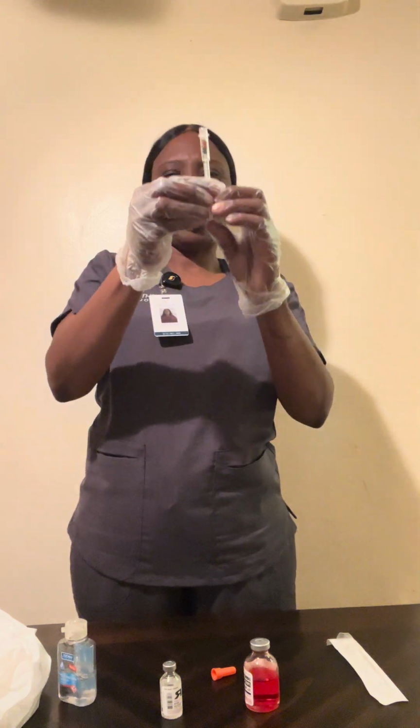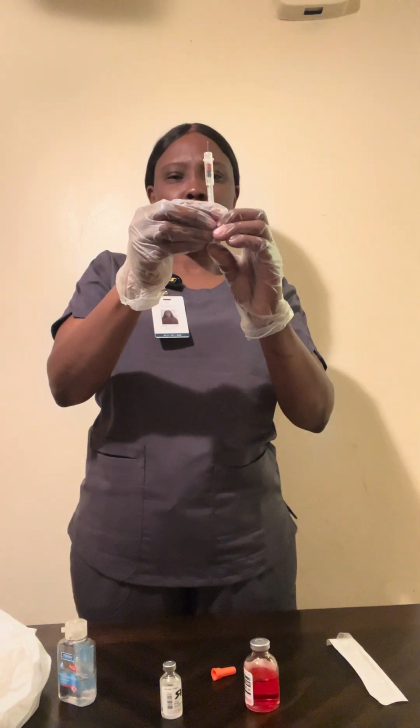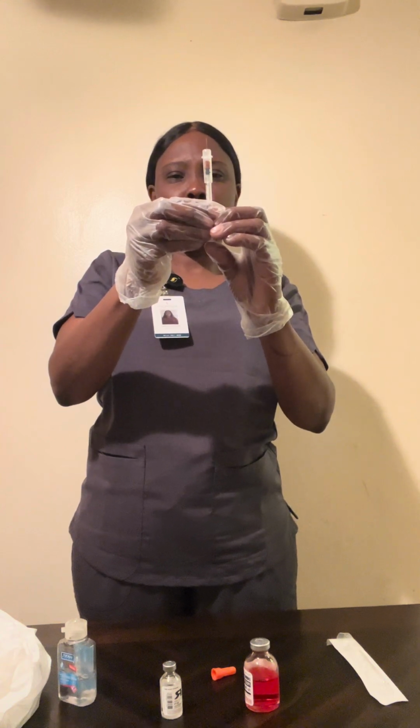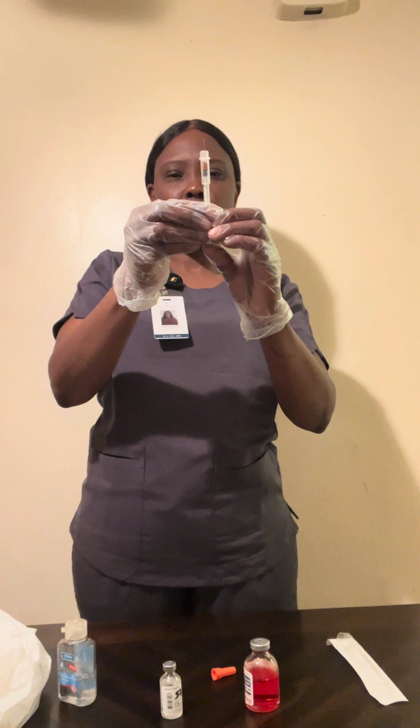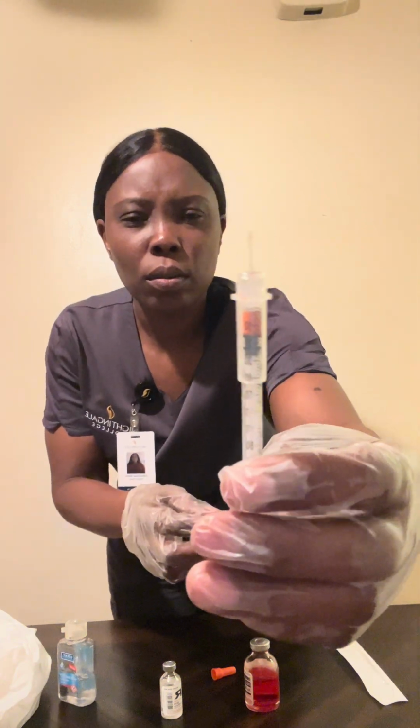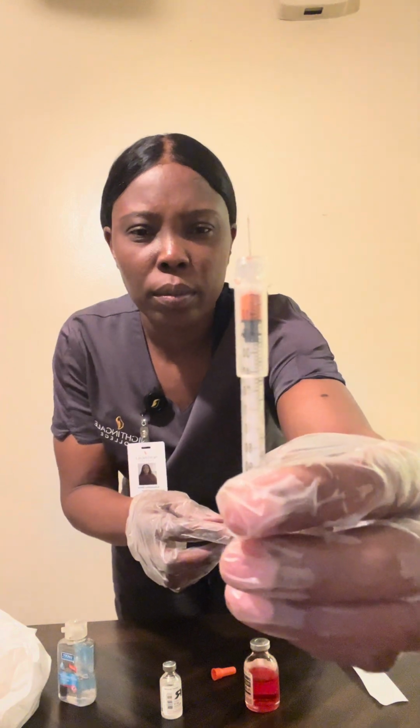I'm going to tap for any air bubbles. I'm going to make sure this is the total of 12 units.